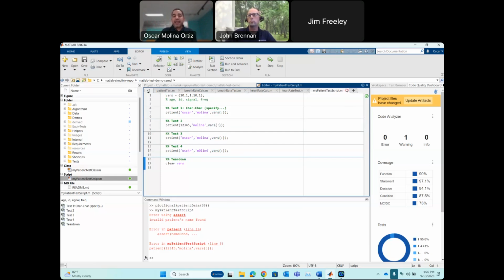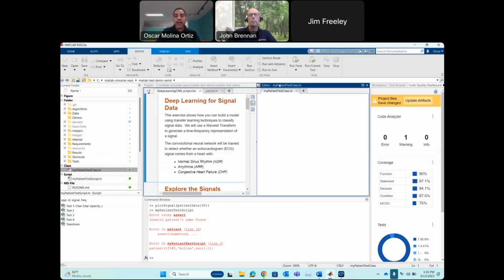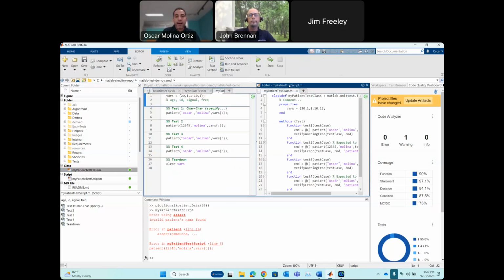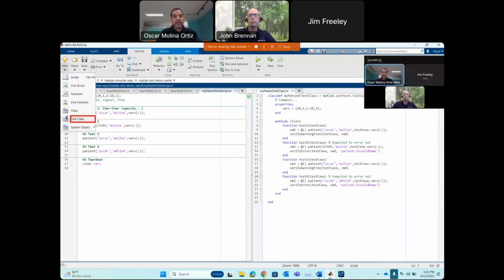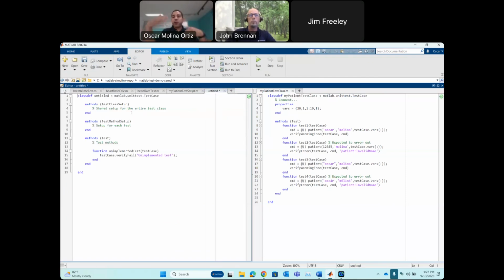Now, we can do this in a better way. What we can do is use what we call class-based unit testing, or creating a unit testing suite using a class-based approach. How do you do this? Let me show you back to back what that means. First of all, if you want to create a class-based unit test suite, you can come here to the new option, and here you have this test class option. When you do that, MATLAB gives you the structure of a class-based unit test.